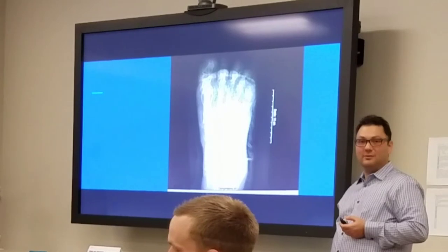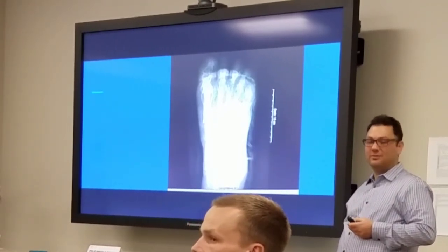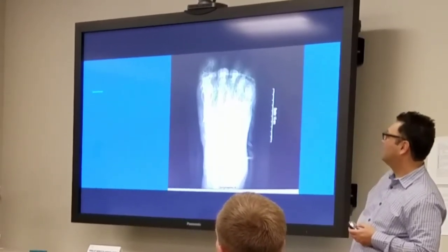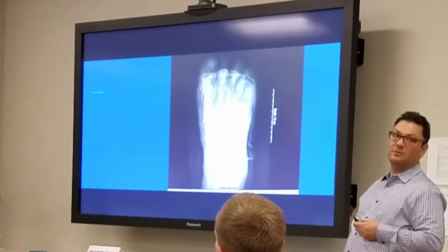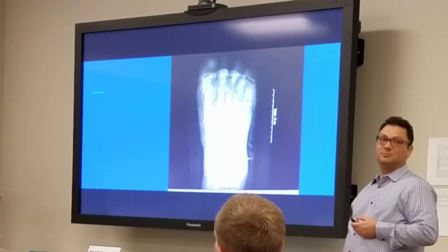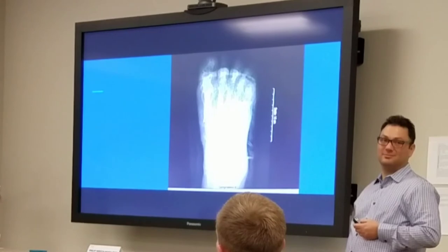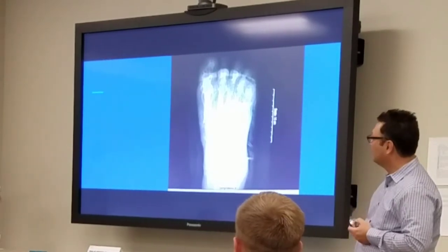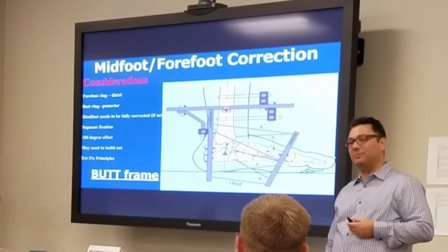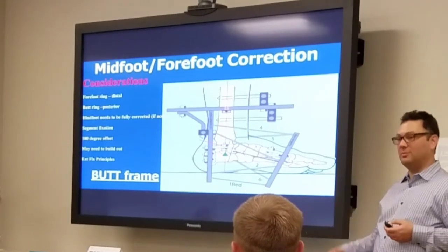These are friendly until you try to take them out. They are absolutely miserable to get out because the threads on the distal portions are not reverse threaded and are the same size as the cannulation. When the Charcot bone mushes around it, you literally bang them out, because you put a tamp against them and bang them out the back of the calc, out the back of the talus. They're horrible to take out. So pray that you never have to take them out. Mine don't, they back out themselves before I have to take them out. So that's something to keep in mind.